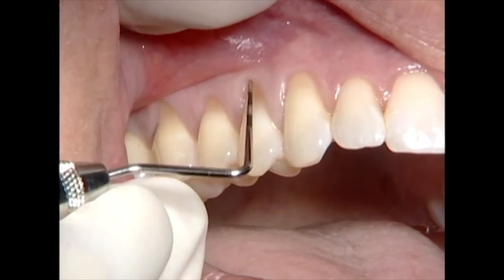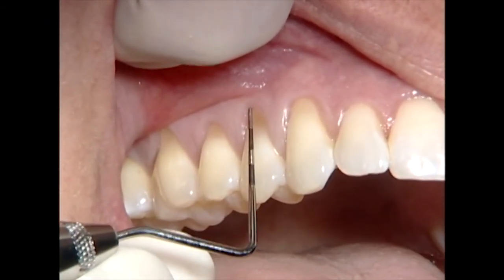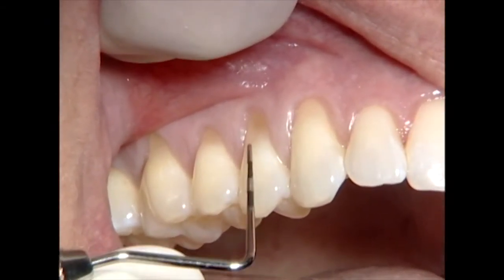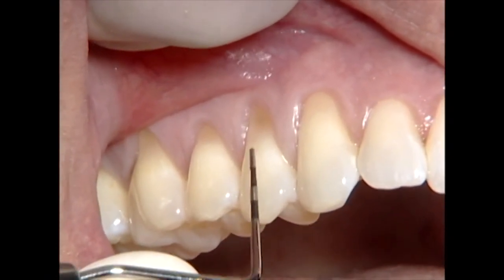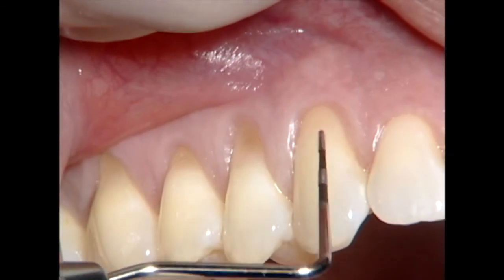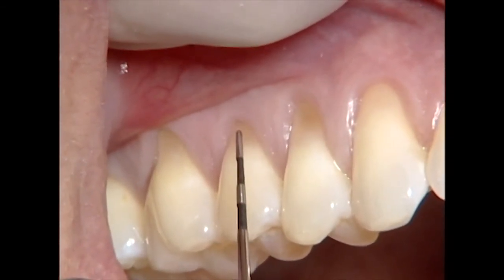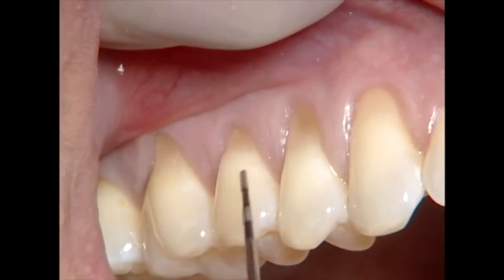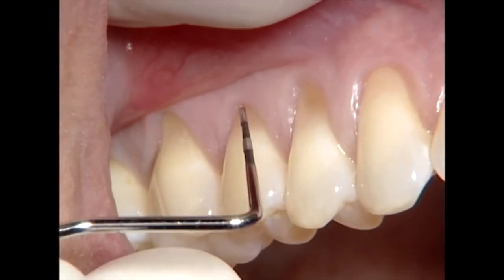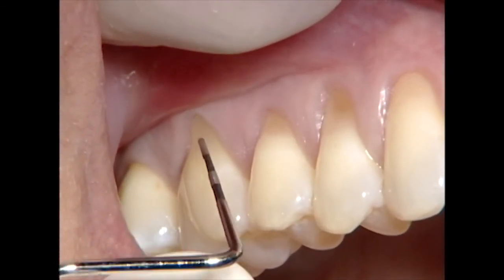There's a significant notch here with a ledge at the gingival margin that I talked about before. We have maybe four millimeters of recession on the first premolar. There's only maybe two and a half millimeters recession on the canine and maybe three on the second premolar with a little notch, not much of a ledge. And a little notching with a ledge on the molar.